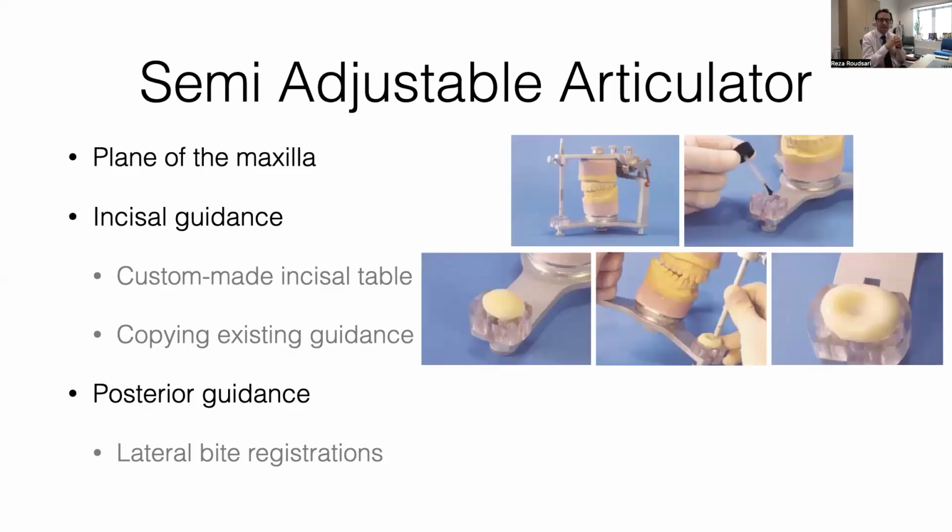So just to tell you how it works, let's say, for example, you are going to make a patient 6 crowns, and you want to make sure that they are following what your provisional crowns have got. So let's say a patient has got worn down teeth, you decided to crown the anterior maxillary 6 teeth, and you prep them based on the wax-up you've planned.